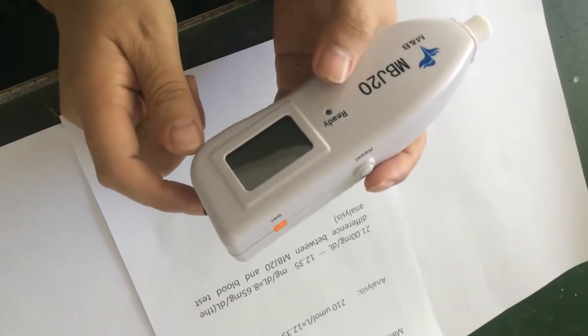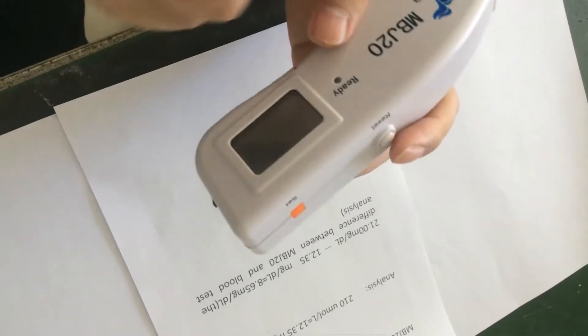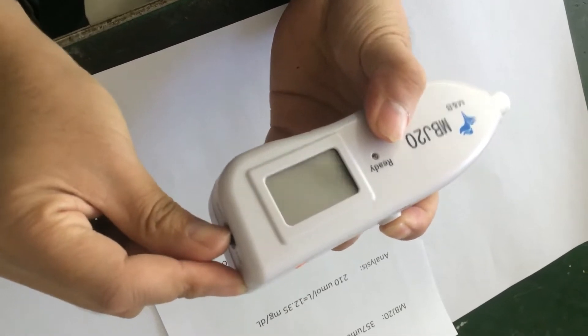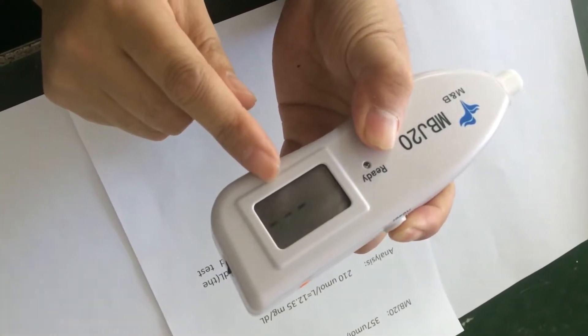Let's enter the calibrating interface. First press this reset button, at the same time switch on here, and wait until the number appears.